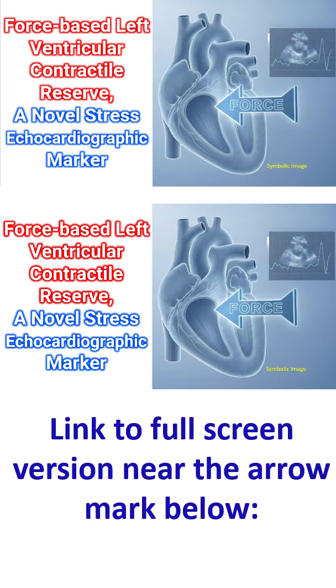Stress echocardiography, often done by giving a dobutamine infusion in graded doses, assesses regional wall motion abnormality for indicating critical epicardial coronary artery stenosis that mostly determines subendocardial underperfusion. Recent introduction of evaluation of left ventricular contractile reserve based on force has enriched the core protocol of stress echocardiography.